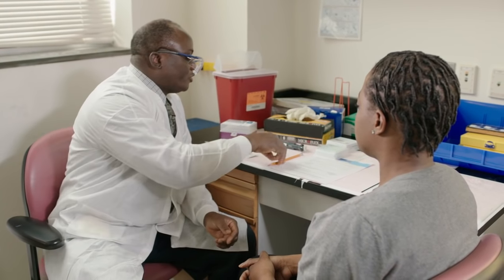Good morning, you are welcome. Please may I know your name? Ama Semenya. The doctor has referred you to the laboratory for us to collect your blood sample and to find out whether you've got malaria parasites in your blood or not. We're going to prick your middle finger to collect the blood sample from you and then to be able to carry out investigations that we need to do.